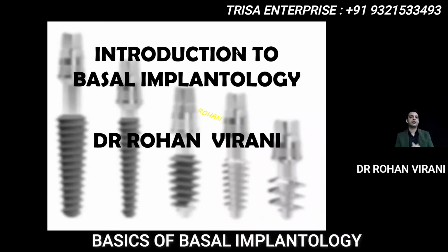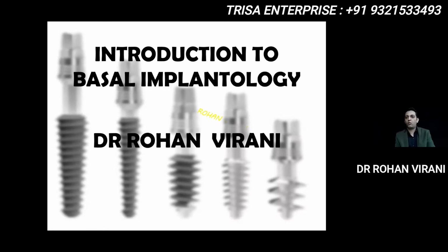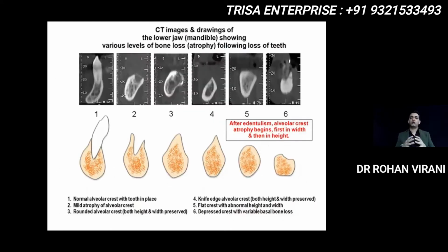Introduction to basal implantologists. As I see, a lot of you are beginners in the group, and all of you would want to know why exactly you should start this amazing system in your practice. As we all know, doctors, patients come to us at various stages of life, and bone atrophy is there. Whenever tooth loss occurs, as you see in this sequence 1, 2, 3, 4, 5, 6, you will always find the patients have lost some amount of bone when they come to us.